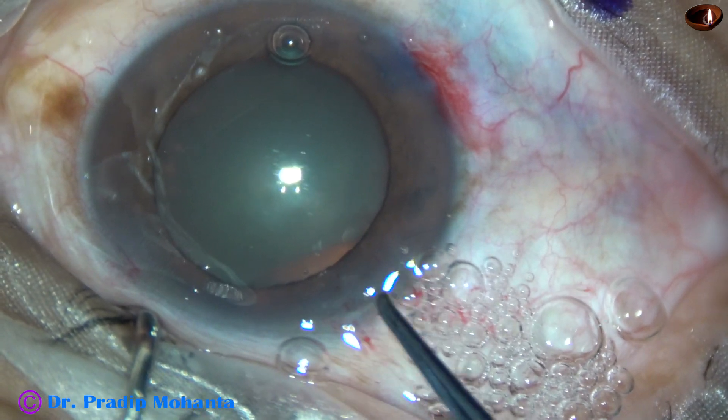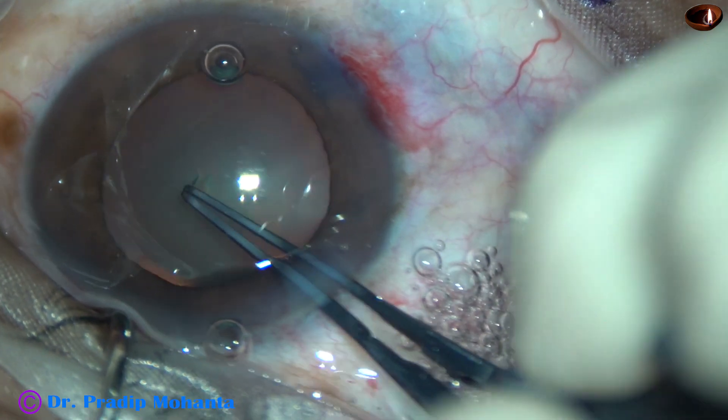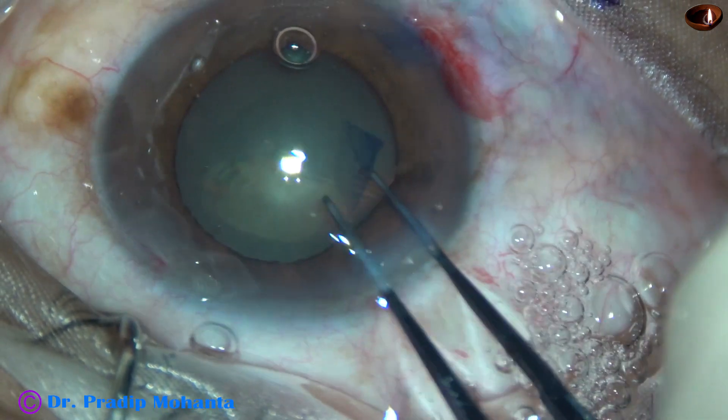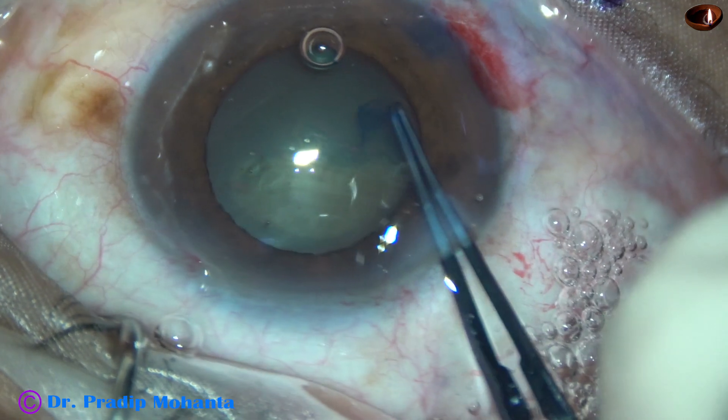This is a cataract with grade 2 nuclear sclerosis and a mid-dilated pupil. The pupil became very small while managing the nucleus. Let us observe this surgery.